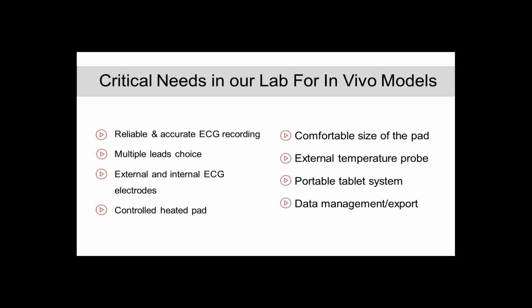And obviously, the multiple lead choice is also very beneficial. I know that some of the guys in our lab use, as Dr. Lindsay said, one lead, lead number 2. I prefer to use 3. I don't usually go over more than 3 leads just because it sometimes gets overcrowded, but it's a very good option anyway to acquire the ECG. You can use either external or internal electrodes. That basically means that you can either poke the mouse with the electrodes and record it like this, or if you don't want to induce any more stress to the mouse, like post-MI, for example, you can just use the external electrodes, which are built into the actual surgery pad.